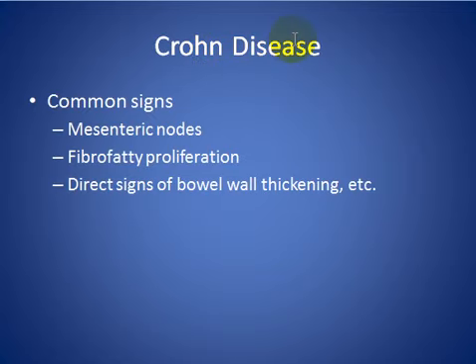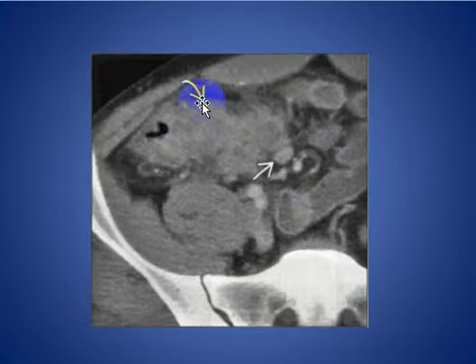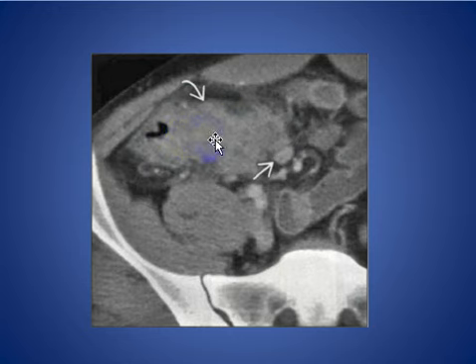Crohn's disease: common signs include mesenteric lymph nodes, fibro-fatty proliferation, and direct signs such as bowel wall thickening. As seen here in this patient with Crohn's disease: thick-walled terminal ileum with surrounding inflammation associated with multiple small mesenteric lymphadenopathy.